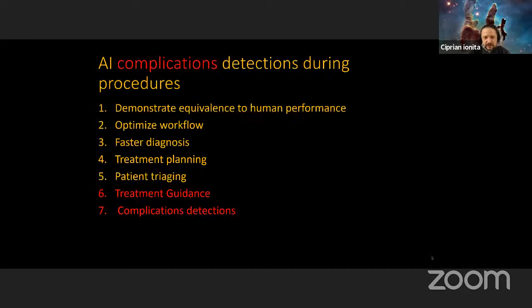The next thing that we have talked about is to detect complications during the procedures. With many cases and subtle changes in the flow, in the angiograms or images, there might be a chance sometimes that complications or small adverse events are not noticed, and we think that AI in this case may enhance the neurosurgeon's practice or procedure by identifying these potential complications and flagging them.